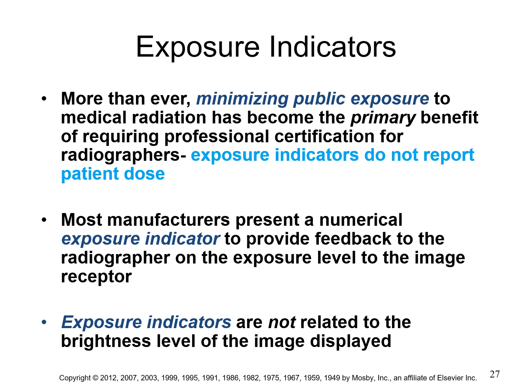Exposure indicators do not report patient dose. They report how strong your remnant beam is. Now, if your remnant beam is stronger than what was recommended, let's say, remember Kodak CR 1800 to 2200, let's say you did an exposure.